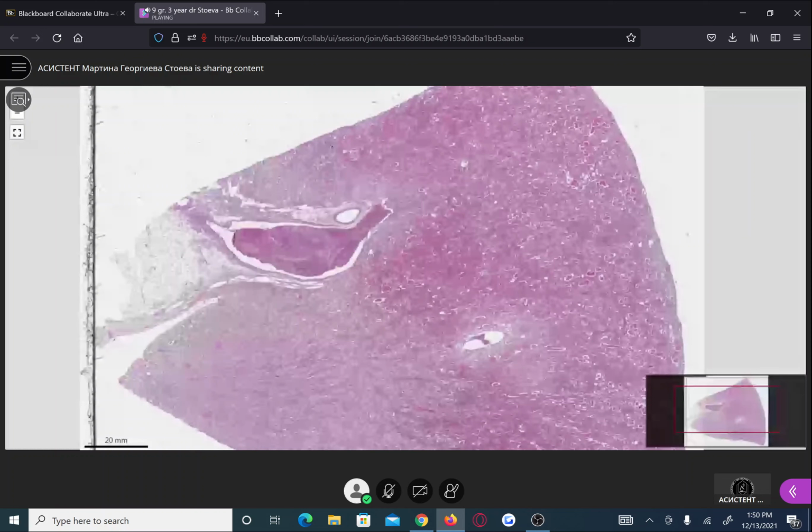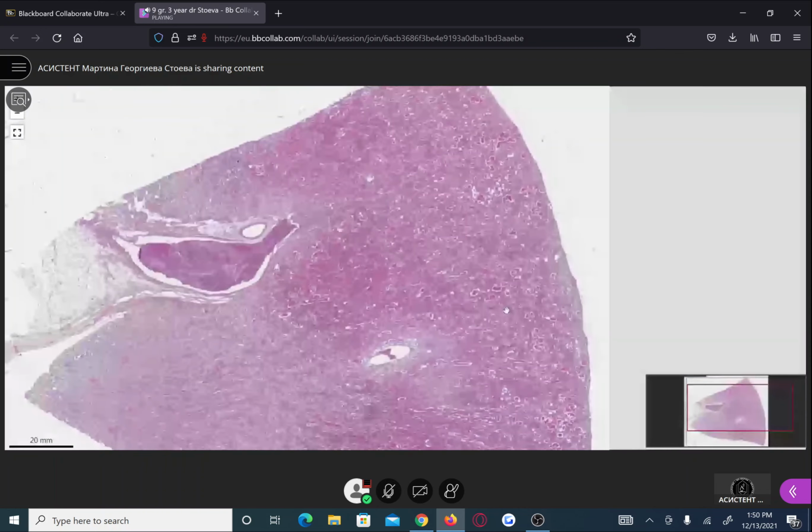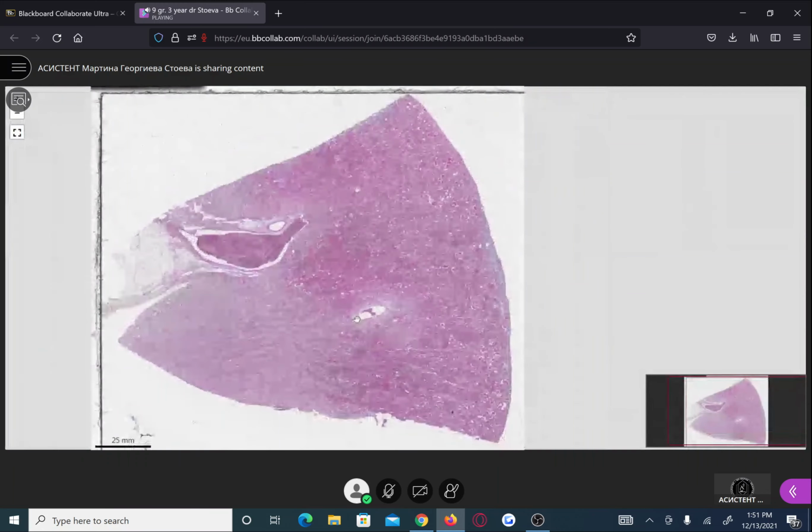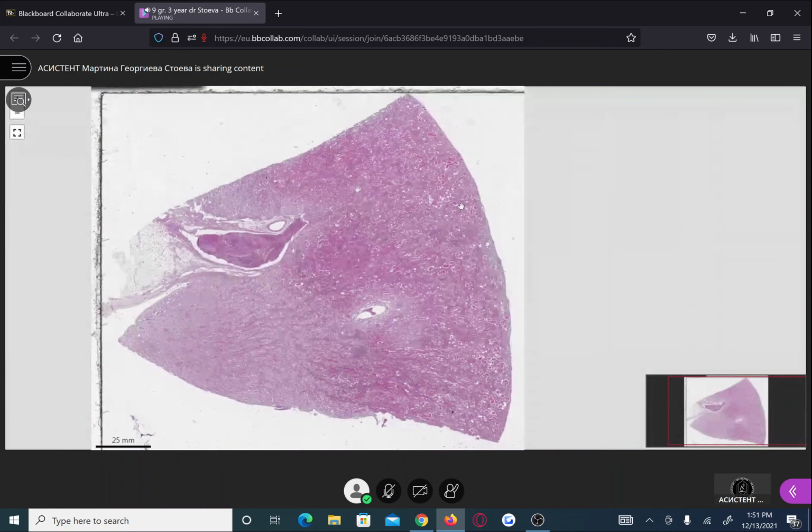So your situation will become more complicated than it is, I think. Of course, if you're asked, you should answer what you see here in the blood vessel. Otherwise, for the slide, if you make the correct diagnosis of amyloidosis, then theoretically you can be asked about the types of amyloidosis, the special staining, of course, and so on.